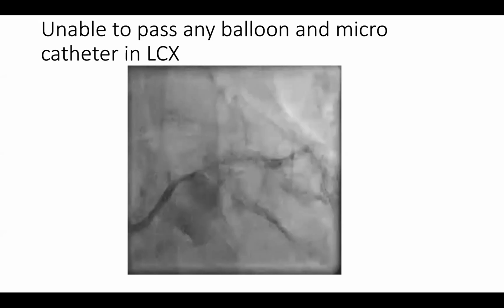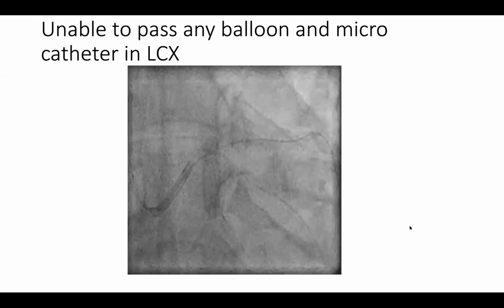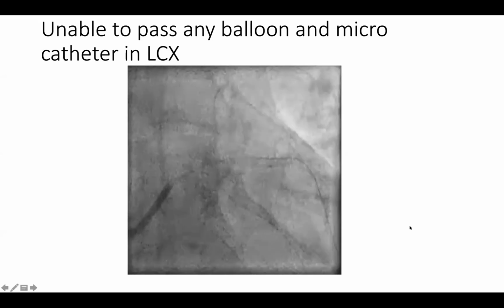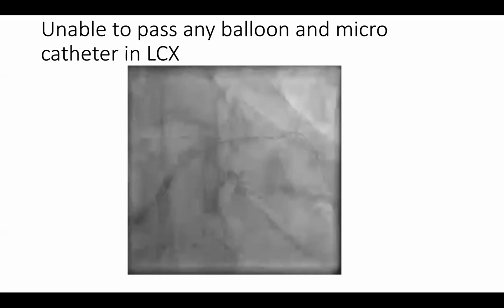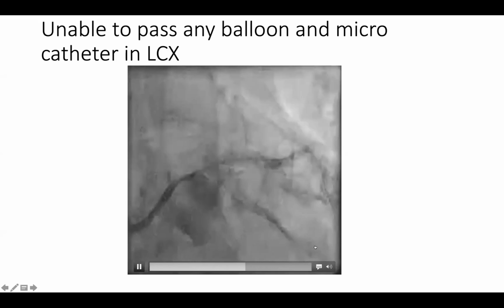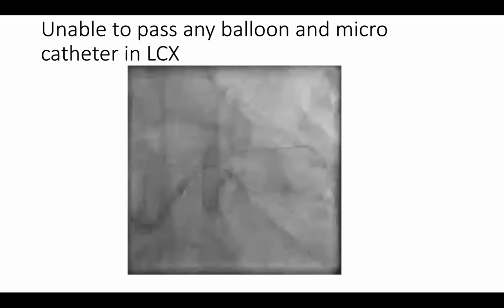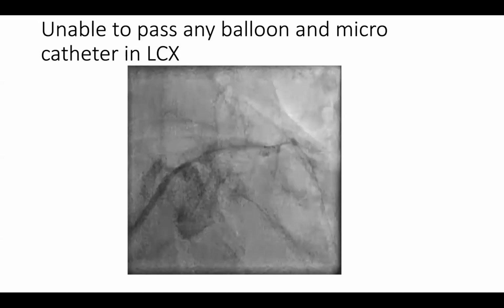And at that time we were thinking what to do, either do the, this is the next question actually, only do the PCI to left main stem LAD, where some audience say that only do the provisional stenting for one artery, or laser, or something else. Do you have laser available? We have laser available, yeah. Okay, then it gives you an option if you have it available.